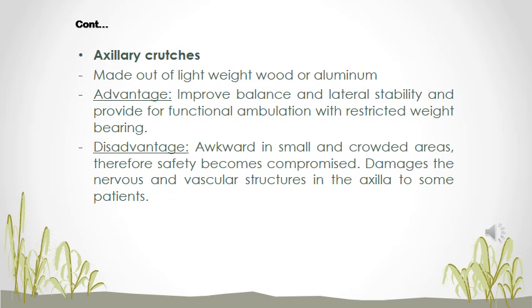Also, because the auxiliary crutches are underneath the axilla, that is where various nerves, axillary nerves, run, and vascular structures as well. When the patient uses axillary crutches incorrectly and leans on them with the upper body too much, it can compromise the neurovascular structures, which makes education and teaching how to use axillary crutches of utmost importance.